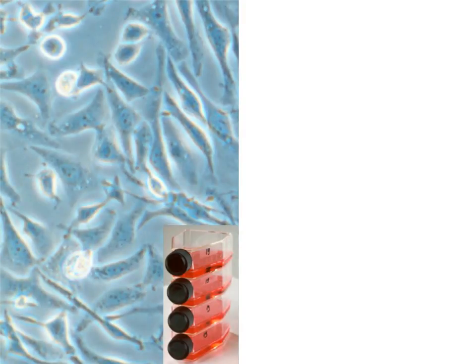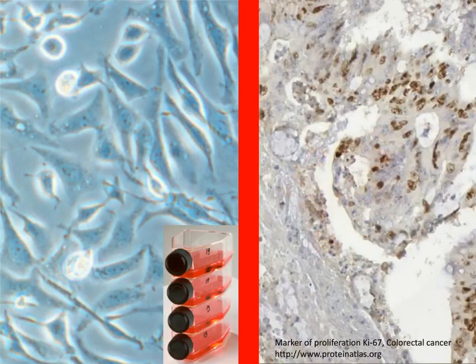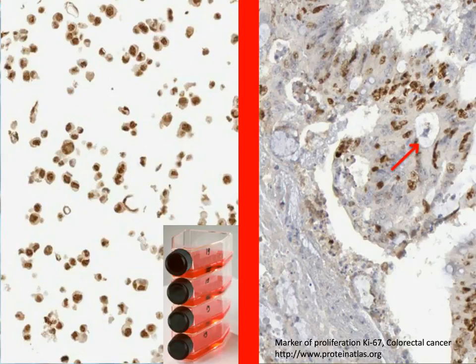However, what we are usually up against looks quite different, like this tumor on the right. Now, if we take a glimpse right into the tumor microenvironment, we can see that this is very heterogeneous. Here we can see a staining for Ki67, a marker of cellular proliferation. We can see in this picture that there are not many proliferating cells, and they are mostly concentrated around what I think is a blood vessel. However, if we perform the same kind of staining in monolayer cell culture, we can see that virtually all the cells are proliferating. What we lack in monolayer cell culture is the part in the circle.